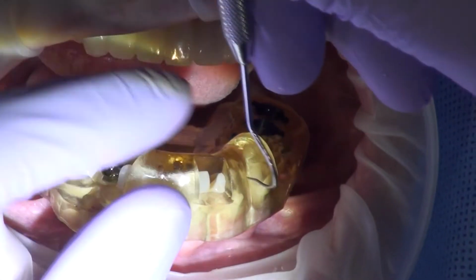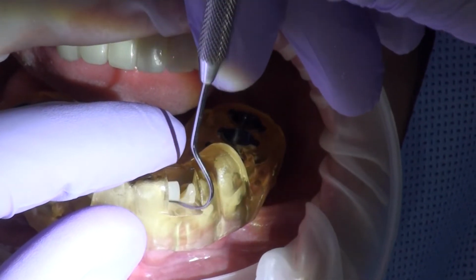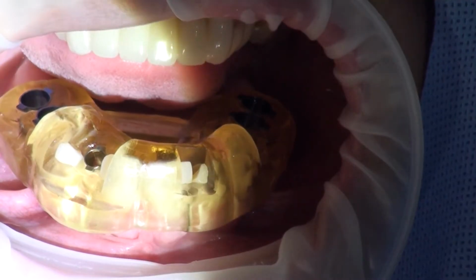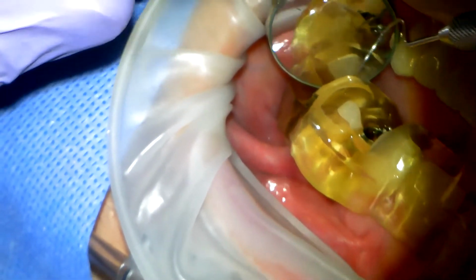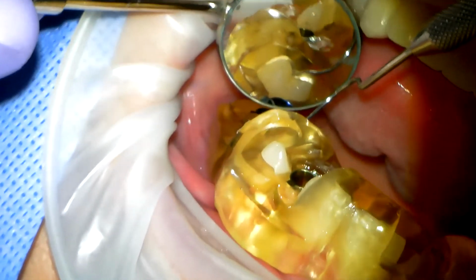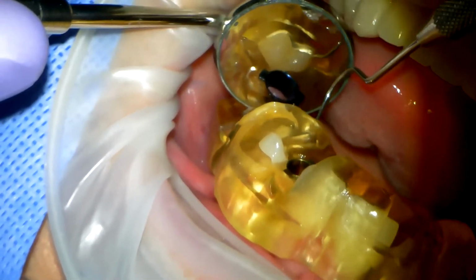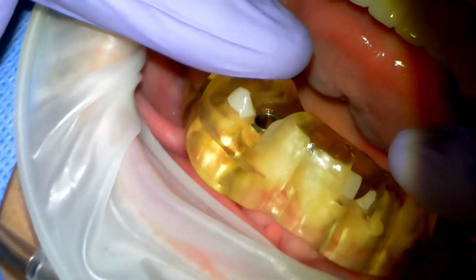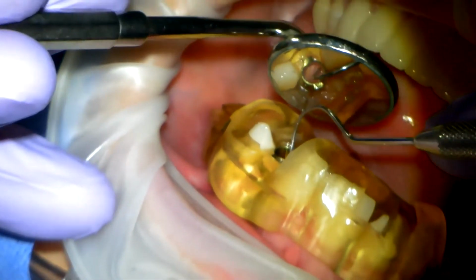Buccal contour, you're seeing same thing right here, same right over there. And if I get a mirror, you can check the distal areas as well. All these little windows are there to help you visualize the guide seated everywhere. Real big for me if you can. Beautiful. That right there is beautiful. That could belong in a textbook. Look at that. Beautiful fitting guide. No rocking or anything. Where we're going to focus right now is in this site.